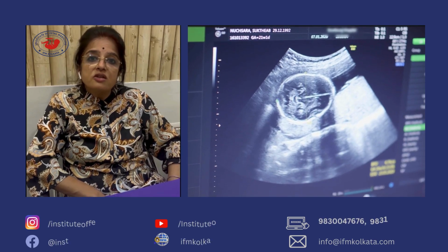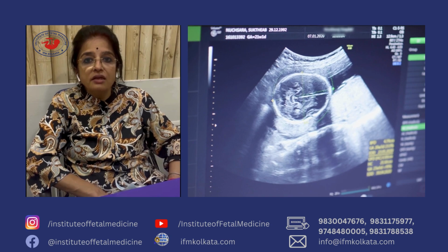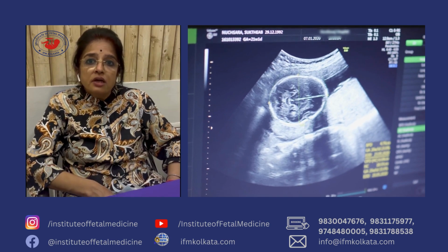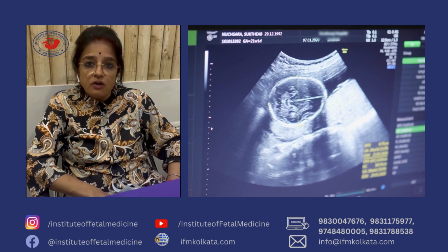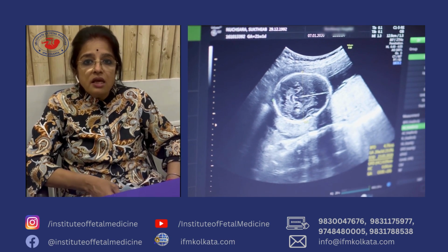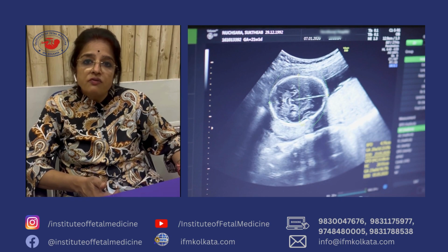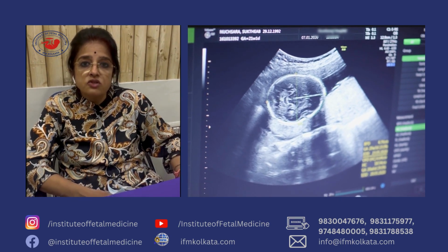There are various ways in which transvaginal sonography has an edge over transabdominal scan. In a transabdominal ultrasonography, where we do the USG from the abdomen, we need a full bladder, without which we cannot visualize the pelvic organs. But in a TVS, we do it with an empty bladder. Secondly, in transabdominal scan, when the patient has a lot of lower abdominal fat, the ultrasonographic window gets very poor and we cannot have a good resolution of the organs visualized.